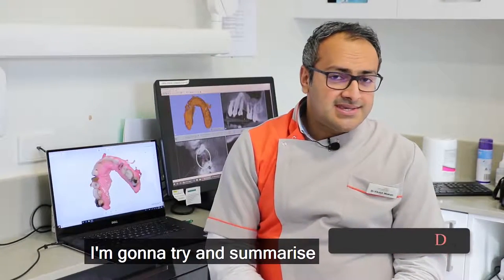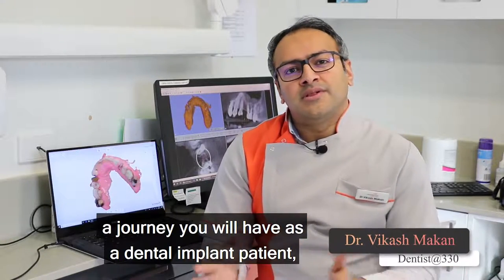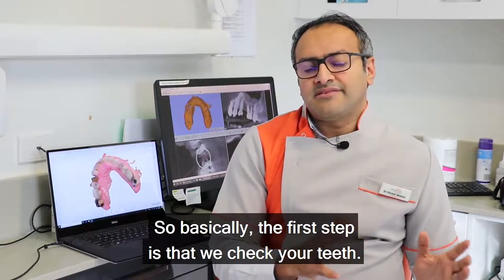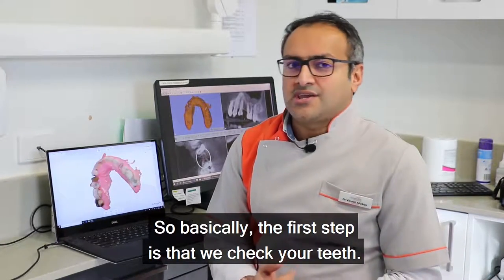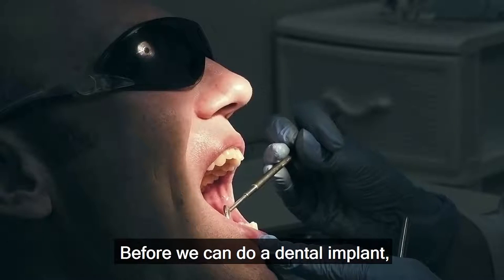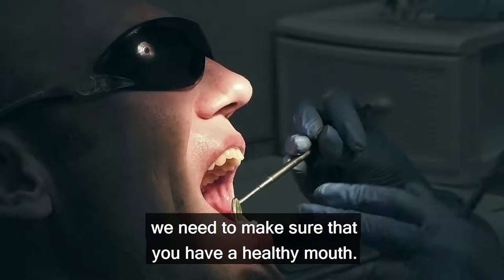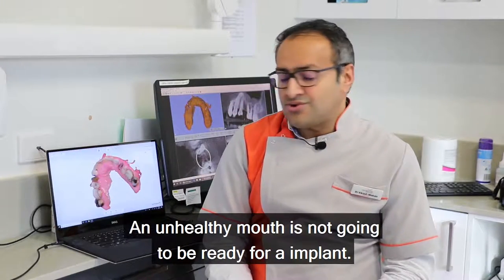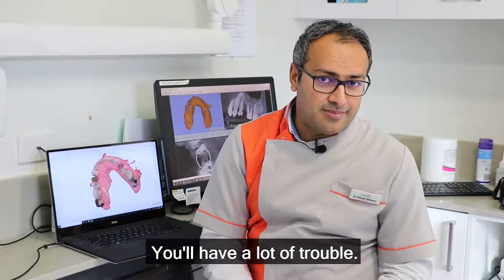I'm going to try and summarize the journey you will have as a dental implant patient, at least in our clinic. The first step is that we check all your teeth. Before we can do a dental implant, we need to make sure that you have a healthy mouth. An unhealthy mouth is not going to be ready for an implant — you'll have a lot of trouble.